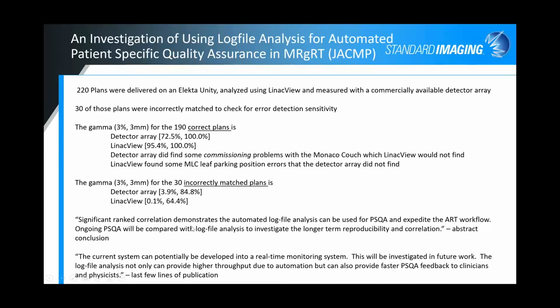So, just to go ahead and read a few quotes from that comparison, the conclusion in the abstract is that significant ranked correlation demonstrates the automated log file analysis can be used for patient-specific QA and expedite the adaptive radiotherapy workflow. Ongoing patient-specific QA will be compared with log file analysis to investigate longer-term reproducibility and correlation.